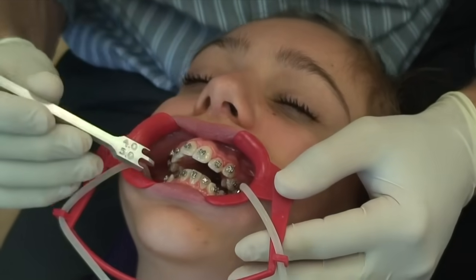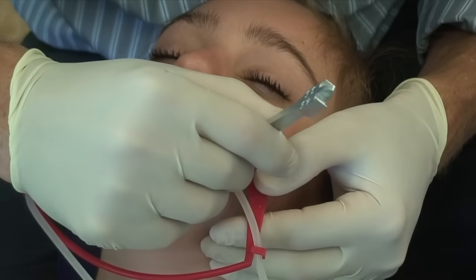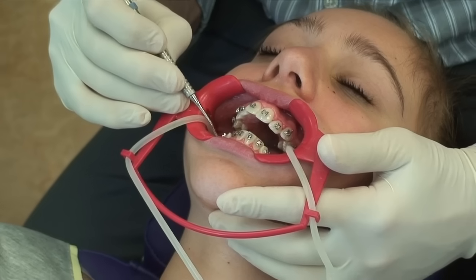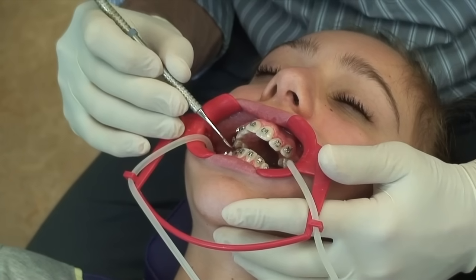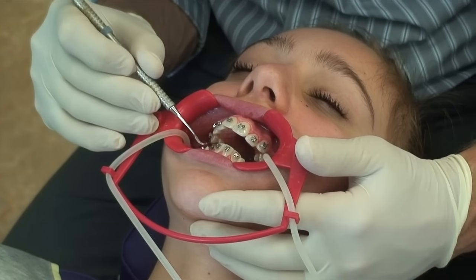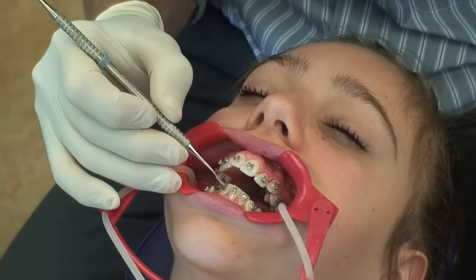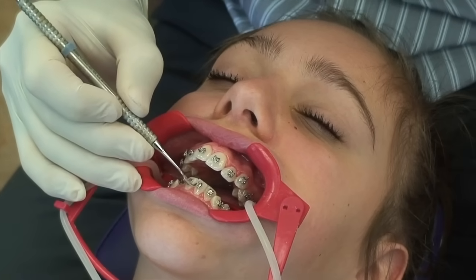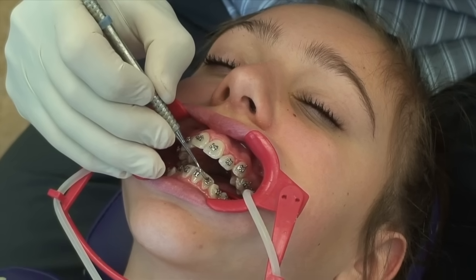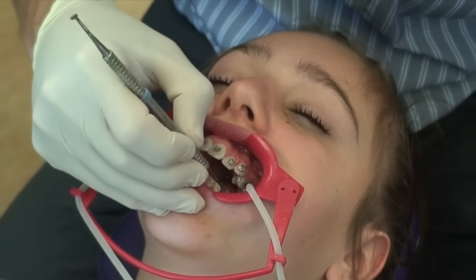A couple of things I want to talk about with the specific brackets is that within those brackets, they actually have what we call a prescription built into them. And that prescription, once we put a wire in, dictates the angulation and the torque or inclination of each individual tooth, as well as the height of each individual tooth within the mouth. So one of the things that's important to me is when I go in and start putting on the braces, I can already envision the teeth in their final position. So I begin with the end in mind. I can already see the final results. I can see the final smile before I even put on the braces.